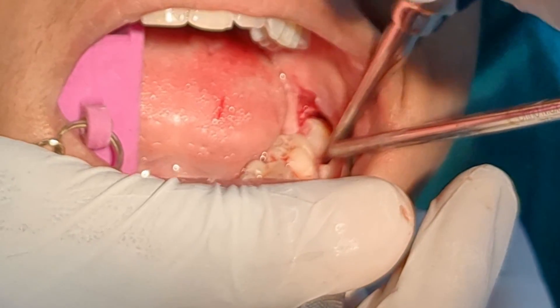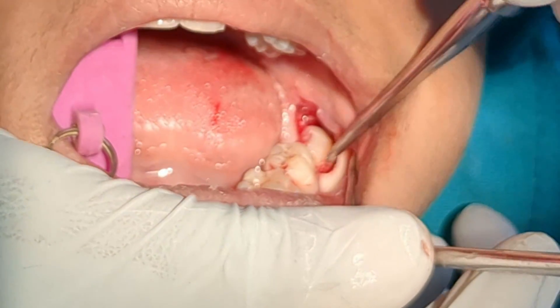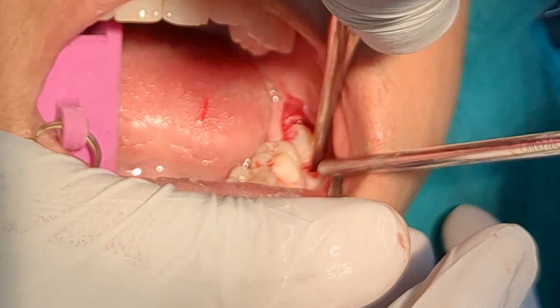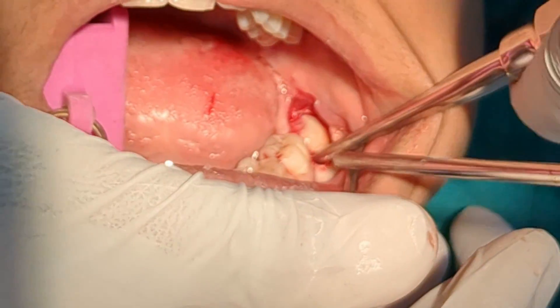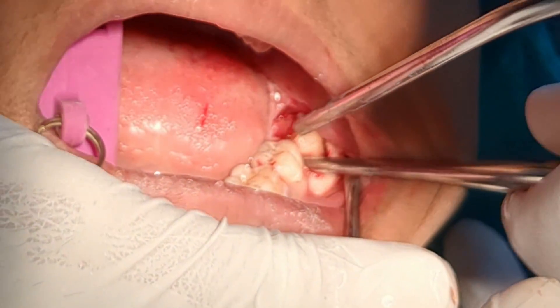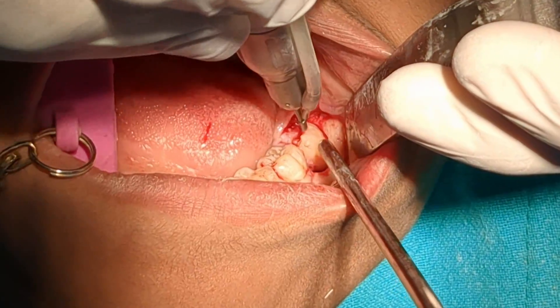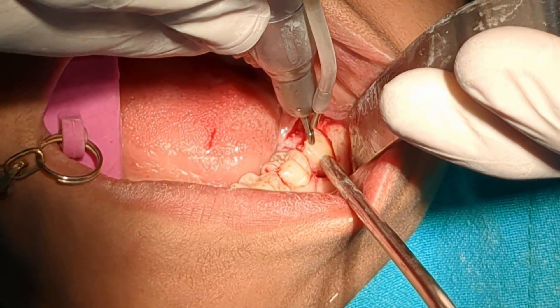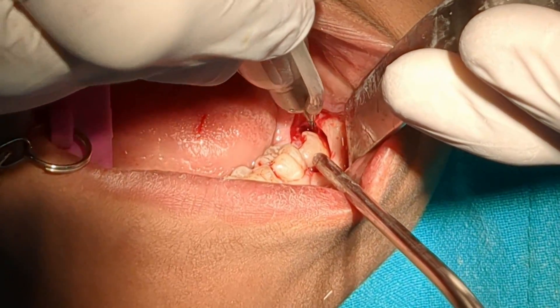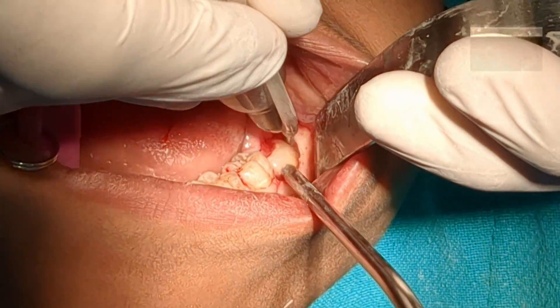I try to elevate the tooth using a Copeland elevator, but due to the presence of excess bone distal to the third molar, I am not able to deliver the tooth out of the socket. So I push the elevated tooth back into the socket and then remove 1–2mm of bone distal to the third molar with a straight burr.